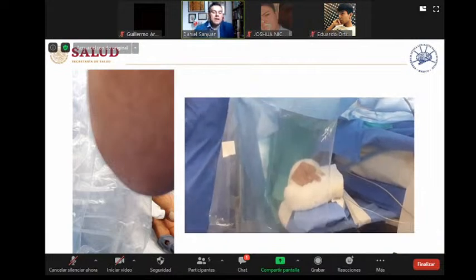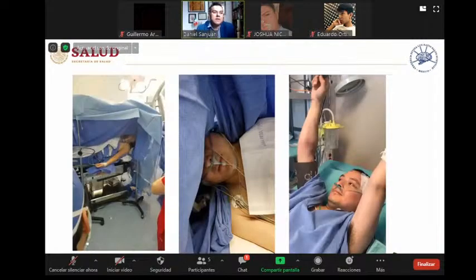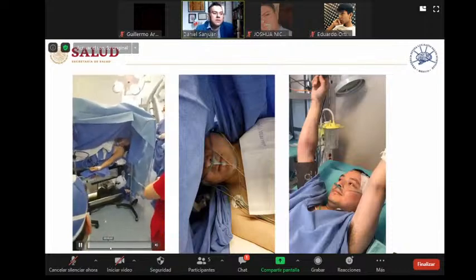So it takes time to localize, and there are different basic movements induced by the stimulation. So I'm going to show another.